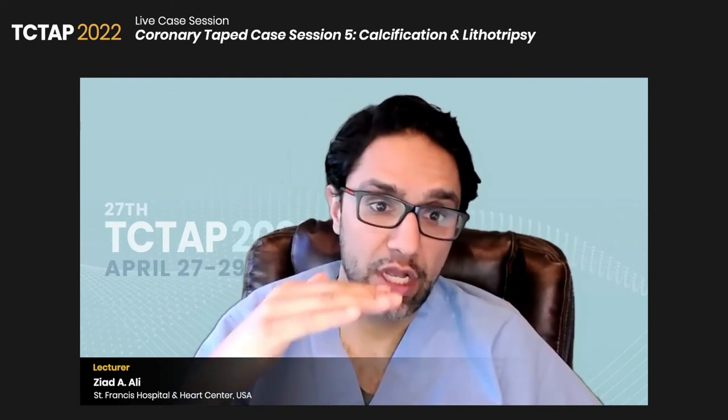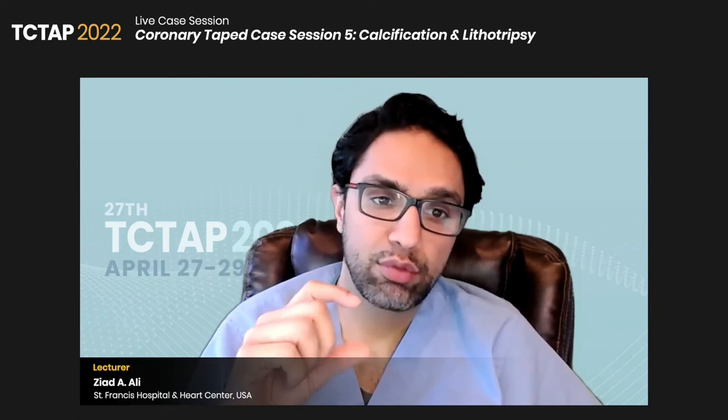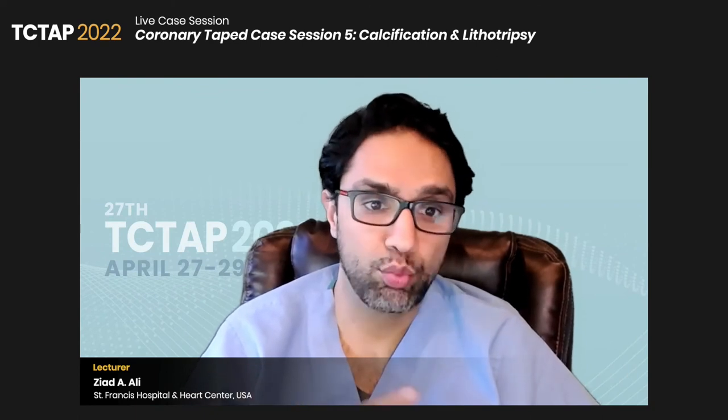So it turns out by intravascular imaging, there are actually three types of calcified nodules. There's a calcified nodule which is like a piece of popcorn on top of Jell-O. When you push the nodule down, it gets pushed into the Jell-O and the stent expands beautifully. That's when you use an NC balloon and you see the nodule disappear and there's no dent in the balloon. That's type one. That's 33% of cases.